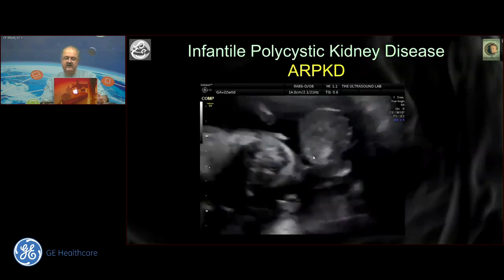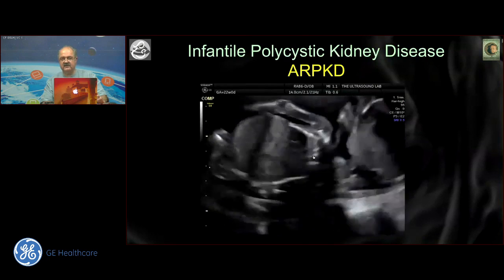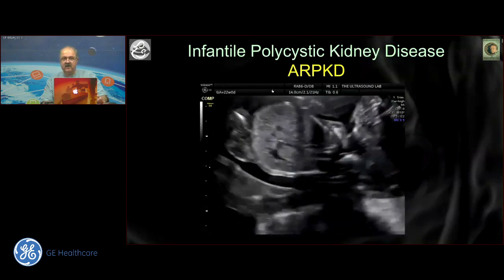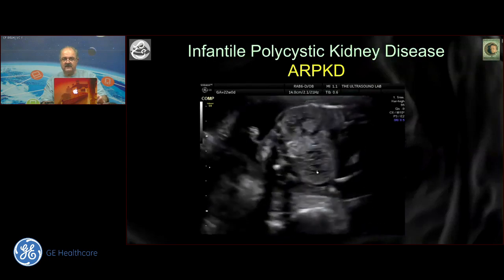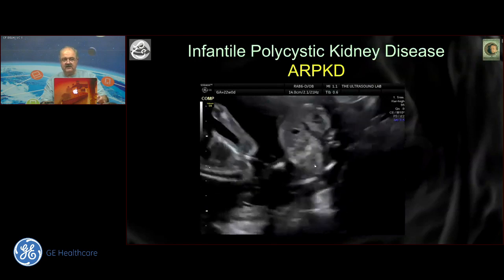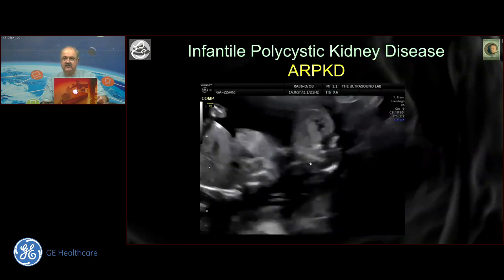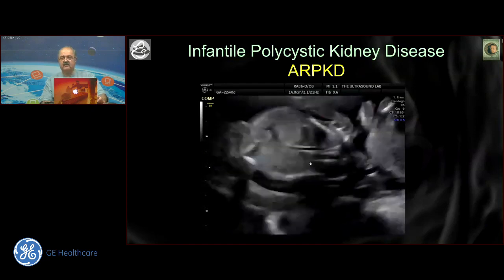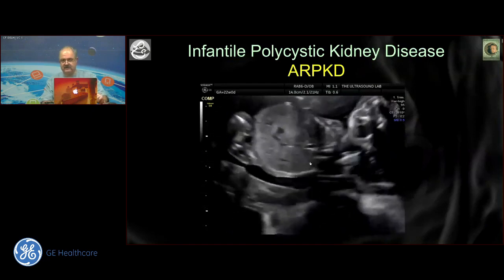And that would be the classic appearance of the autosomal recessive polycystic kidney disease. So it's not always uniformly echogenic. You will find a lot more cystic spaces towards the center. We know very well that it is a cystic kidney and yet echogenic, because the cysts are too small, and all we are seeing are the walls abutting each other, and therefore they don't appear as true cysts.